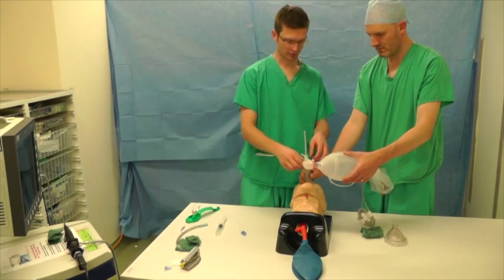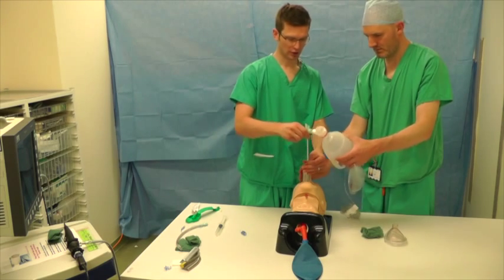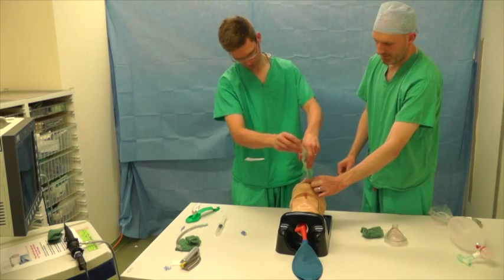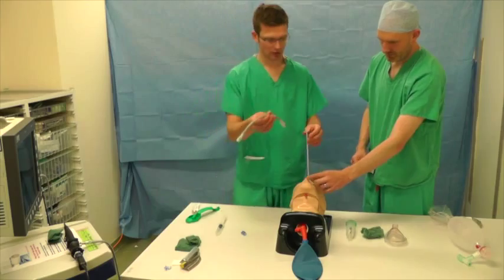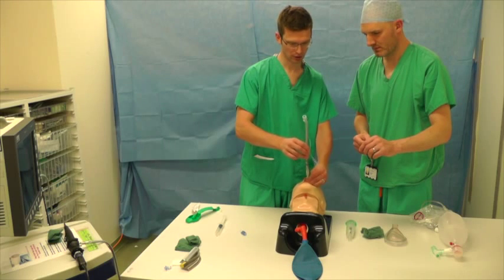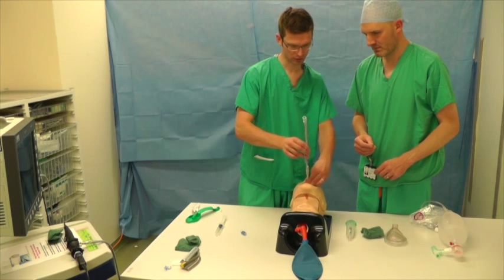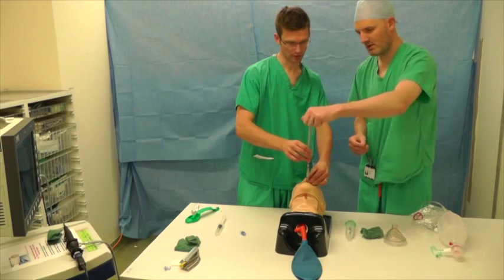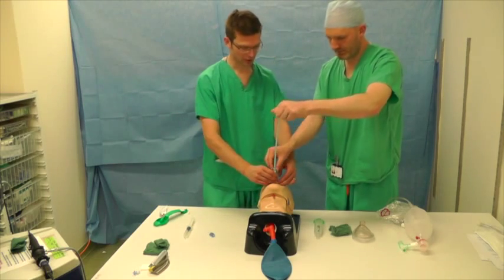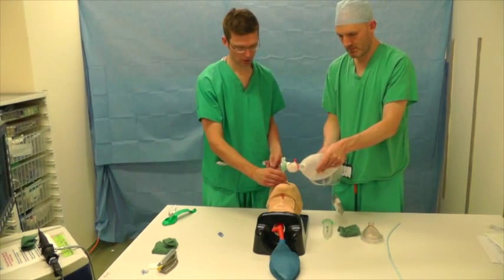Right, okay, so if we just disconnect here we're going to take the iGel out — just hang on to the Aintree if we disconnect this one first. If you can just grab the bottom of the Aintree there. Got it? Okay, great. I've got it. You can come over with the Aintree now. Let's check if you can ventilate. That's fantastic.